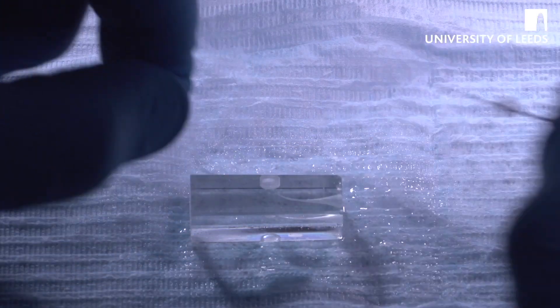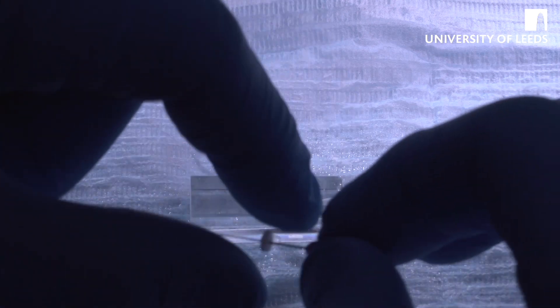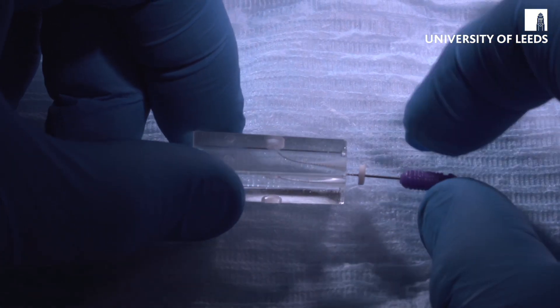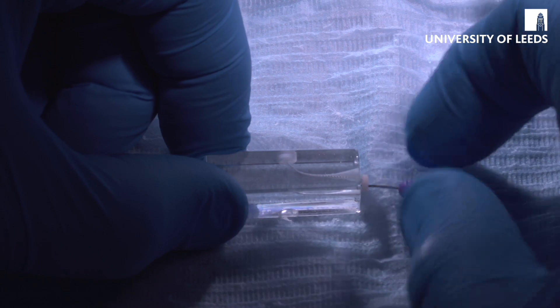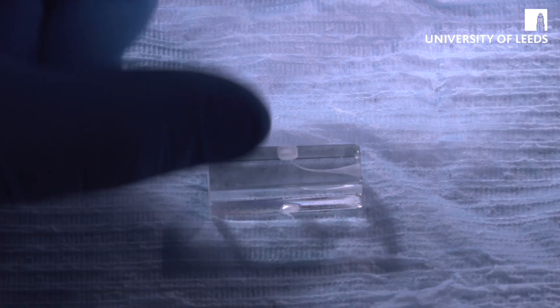This is the point at which, clinically, you would establish the working length using your apex locator. Because these are endo-view blocks, we can't use the apex locator, but we know they are a set length of 18mm, so we'll use our measuring block and set our file to 18mm. Now we're going to do the apical glide path — just going to length, nice and easily, with very small watch-winding movements.